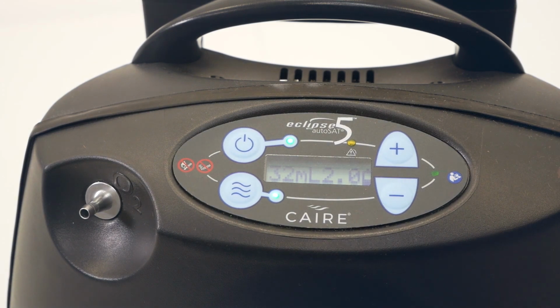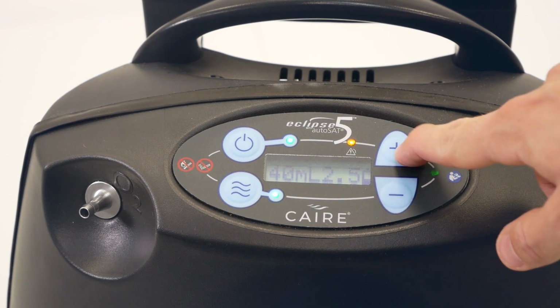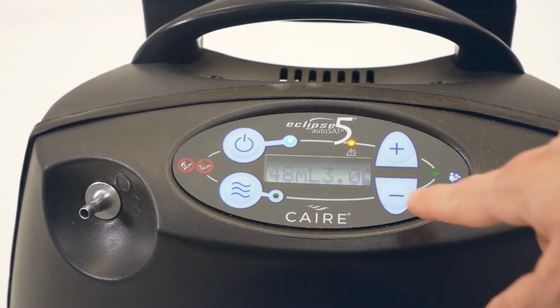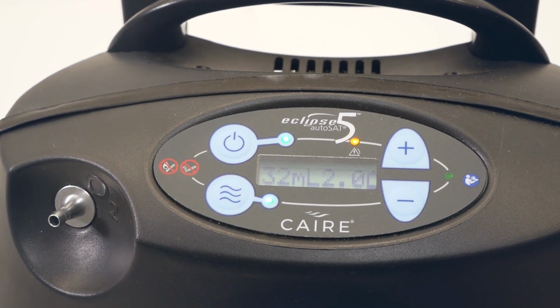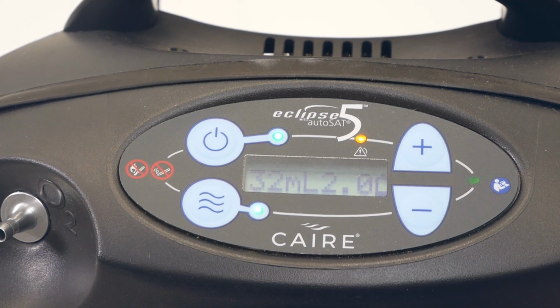The plus and minus buttons increase or decrease the flow rates. Upon installation, the home oxygen provider will set the flow rate for your prescription in either continuous flow or pulse dose mode. There is a battery status gauge. This shows if the device is plugged in and is using either AC or DC power.